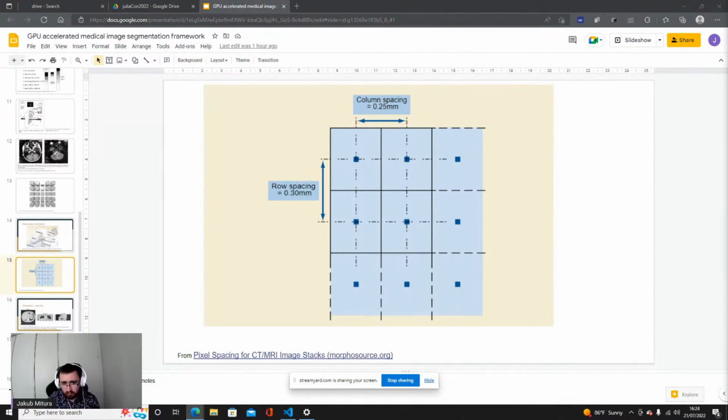There can be thousands of things written in metadata. So basically this three-dimensional array that we will work with will always be the same, and it could be written in some file, but in order to standardize the metadata, we need DICOM, for example. Okay, but very good question.